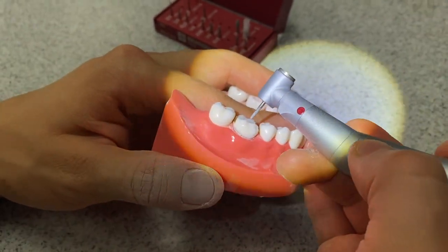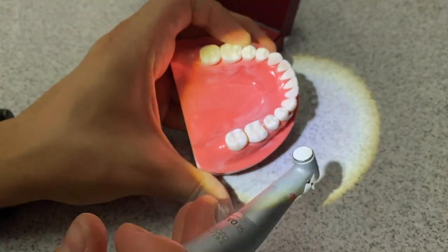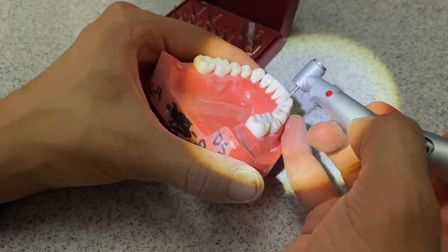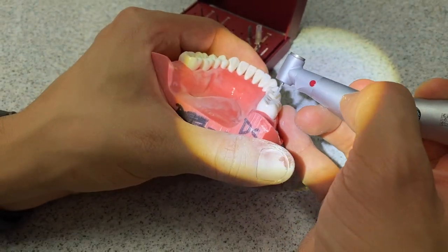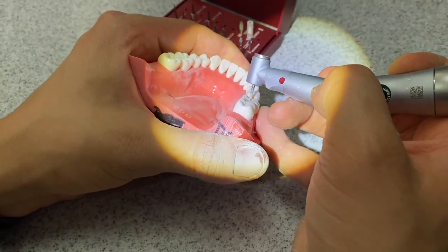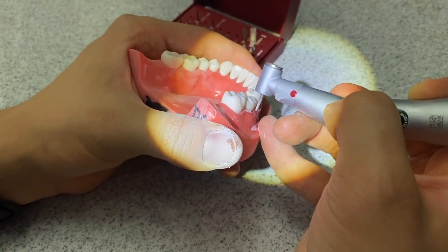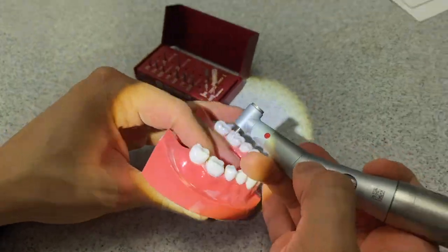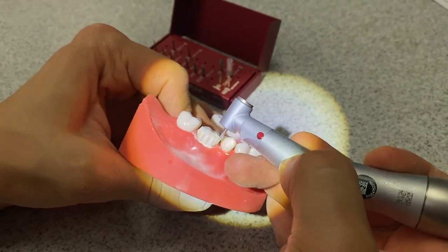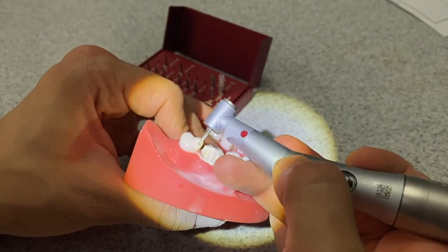We want to make sure we're really staying along the path of insertion of the mandibular teeth. Mandibular teeth have a slight lingual inclination, as you can see. I really recommend you grab your burr before going in and just place it right here — see that lingual inclination — place it on the adjacent tooth, return to that one, and then you can really move on to that axial area. Once you have those depth grooves and depth cuts, you can just connect them.